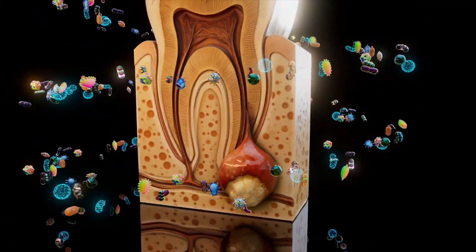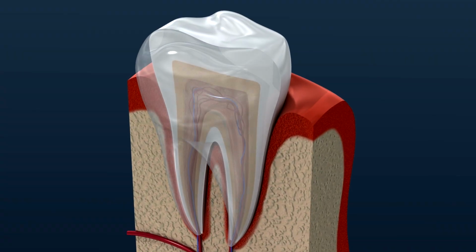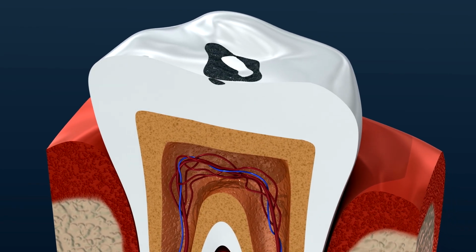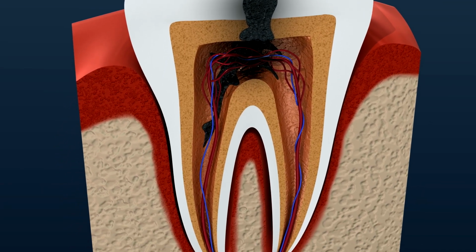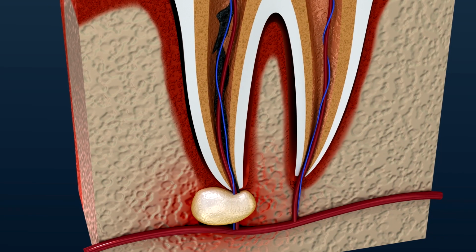This tech uses a combination of laser energy and a fine spray of water to gently remove decay. The big win? Lasers often get rid of the heat, vibration, and pressure that make people anxious, sometimes allowing for fillings with little to no anesthesia. Plus, the laser sterilizes as it goes, which is a nice little bonus.